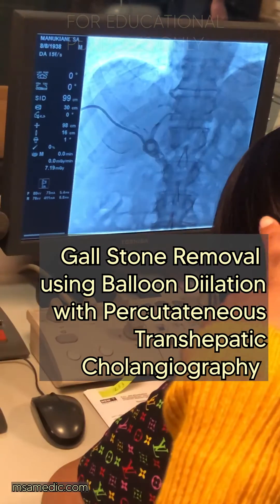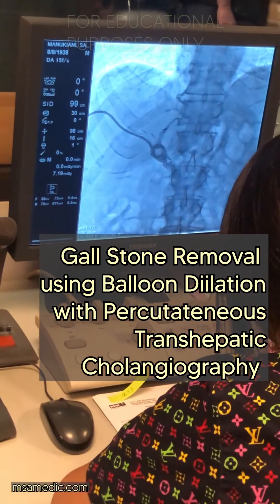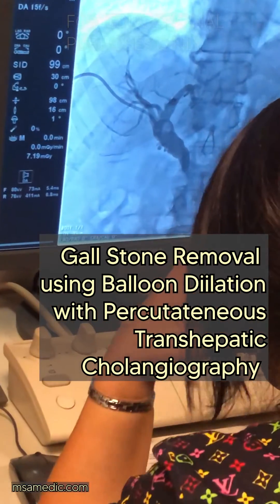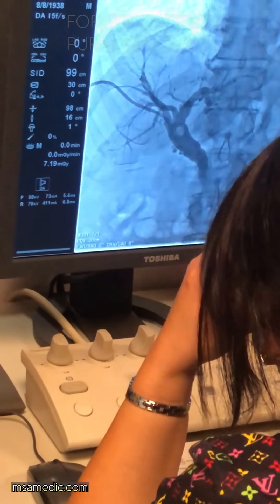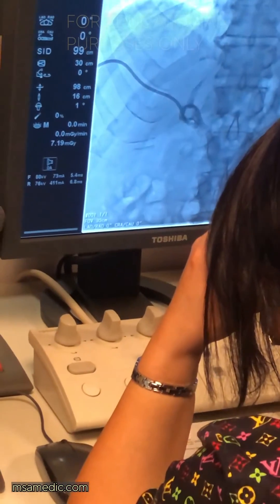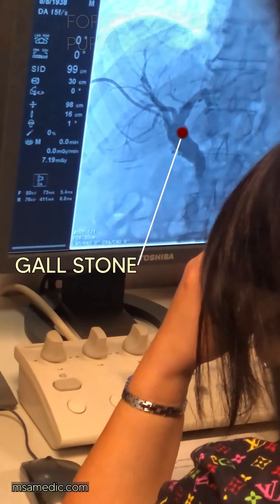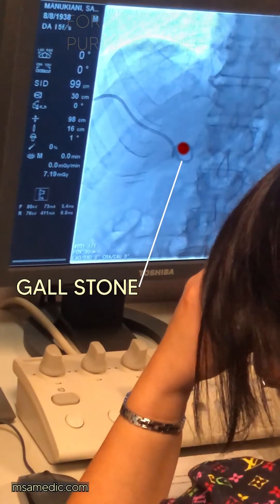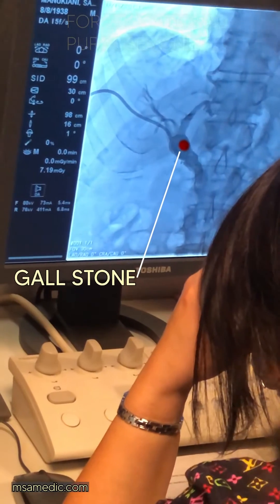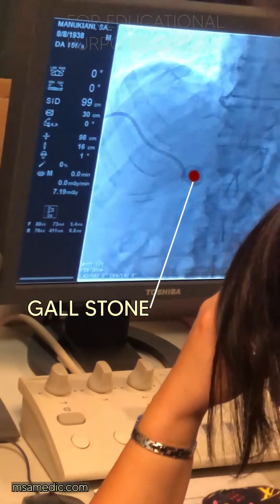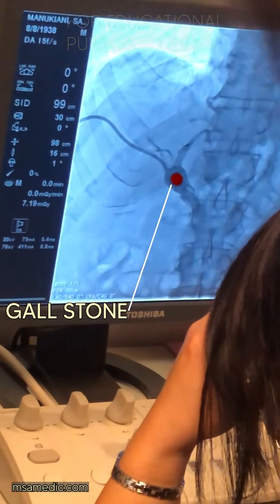What you're looking at is a percutaneous gallstone removal using fluoroscopic guidance. The round structure which you can see here highlighted in red — that's a gallstone.